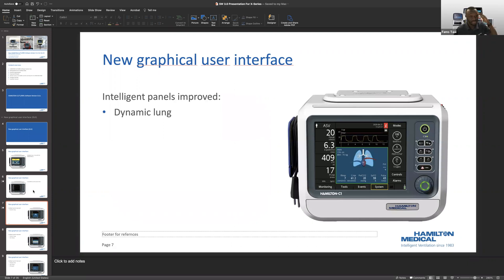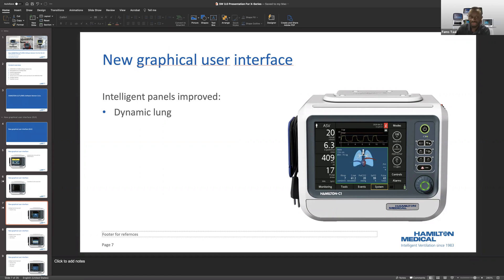Another update is the dynamic lung. As far as what you see, there's no functional difference — it's just the look of it. The 2.0 software shows the bronchial tree in blue; now it shows white. As far as the obstruction changing on the actual screen — say, severe obstruction — those are all the same. If you have somebody who's a big-time asthmatic with a severe increase in resistance, the bronchial tree will turn red, just like with your previous software. The biggest change here is your bronchial tree being white instead of blue compared to the 2.0 software.